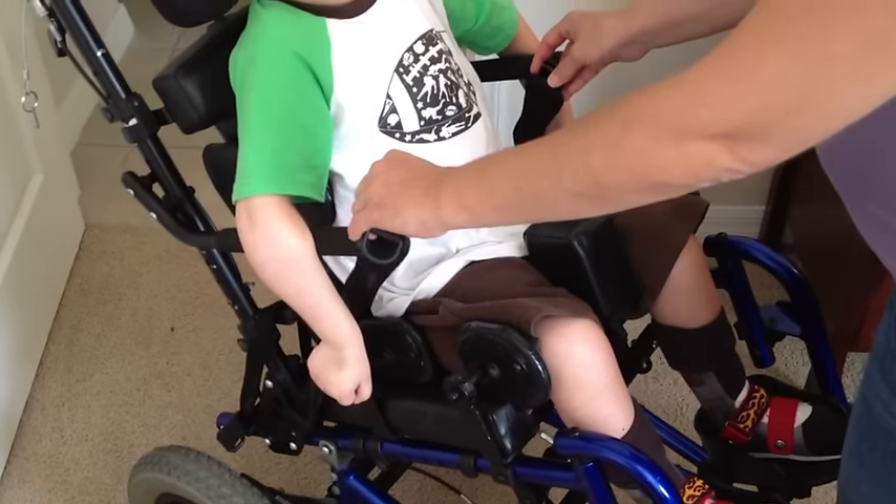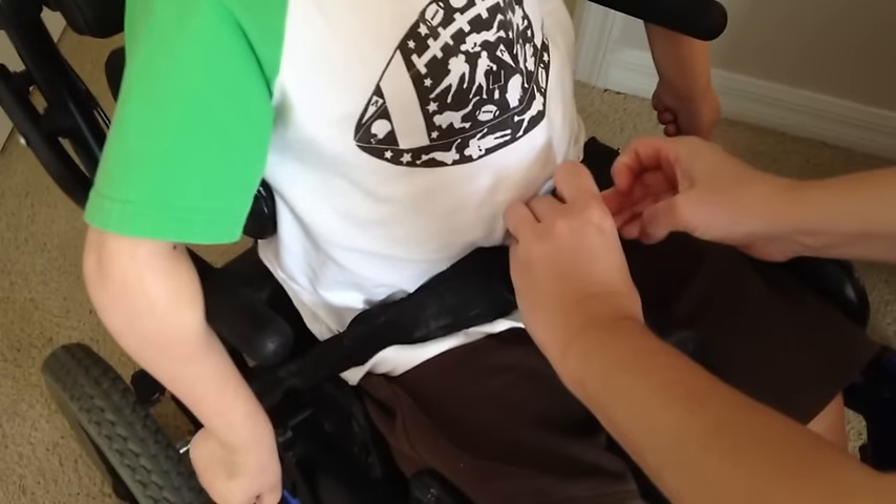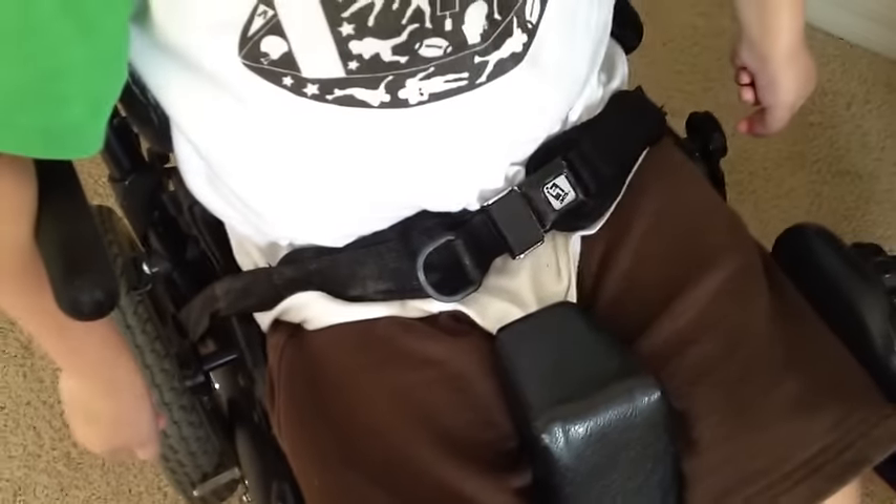You're going to want to pull the two straps down here for his seat belt — they're the ones with the two buckle portions, the metal buckle and the big padding on them. You're going to snap that in and pull it a little tight to make sure it fits nice and snug.